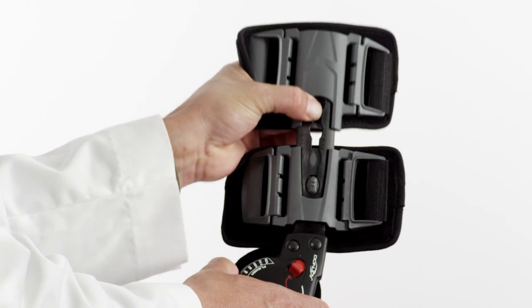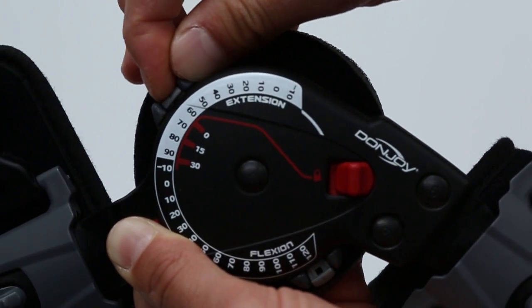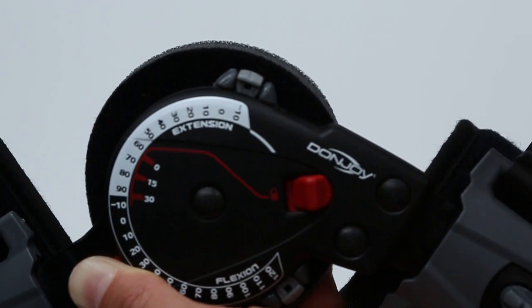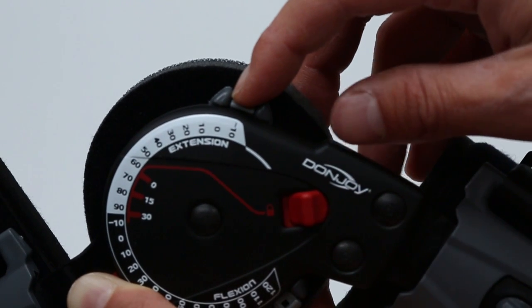One of the unique features of the Exact ROM is the range of motion hinge. The Exact hinge enables clinicians to adjust the brace in a manner that works best for the patient. To adjust the hinge, depress the flexion and extension buttons, then rotate the hinge until you've aligned the button center to the desired angle.